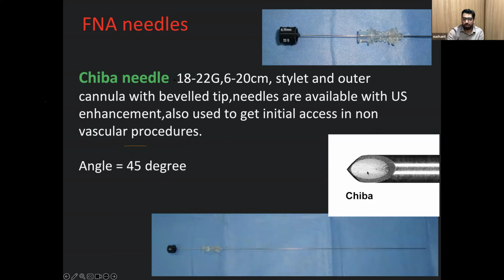These are also available in multiple sizes according to thickness. 18 gauge will be the thicker one. As we increase the gauge, the size of the needle decreases. So the size of the needle is larger if the gauge number is lesser. A 14 gauge needle is a thicker one, and a 26 gauge needle is a thinner one.